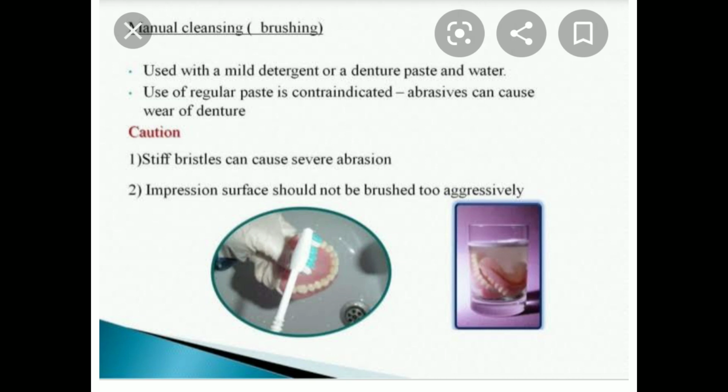They clearly mention we have to use a denture paste and water, right? Caution, what you have to keep in mind: stiff bristles can cause severe abrasion. The impression surface should not be brushed too aggressively, right? This is the point you have to remember when you are cleaning manually.